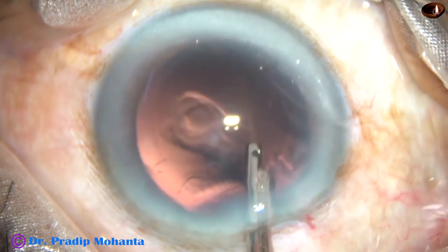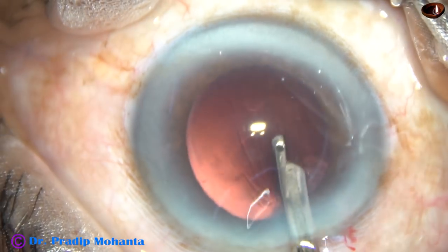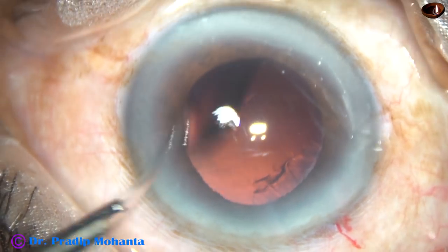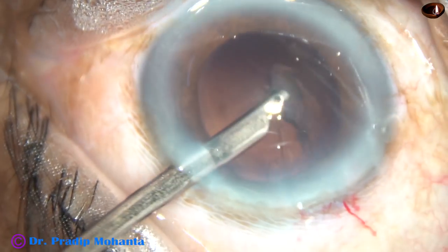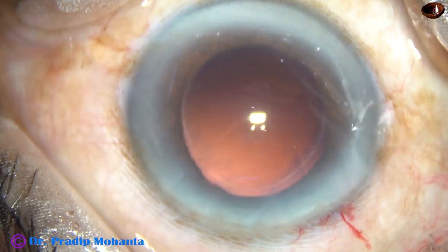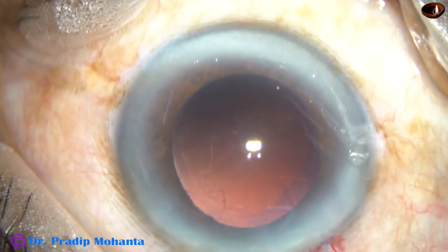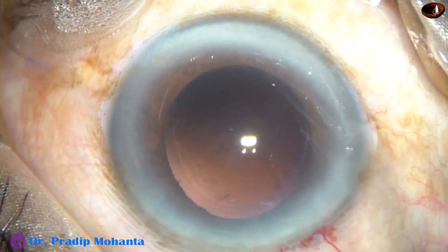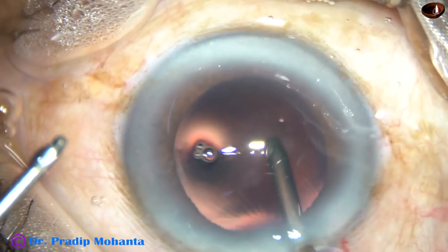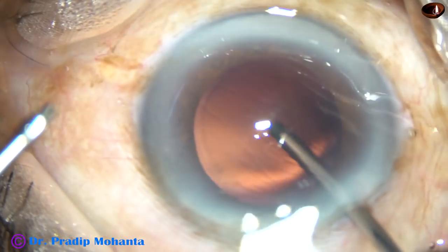There is no epinucleus because in such hard cases the epinucleus is incorporated into the nucleus. Now cortical cleanup — whatever little cortex remains is being removed by a 23 gauge Simcoe cannula. I made only one side port, so I am using this instrument.